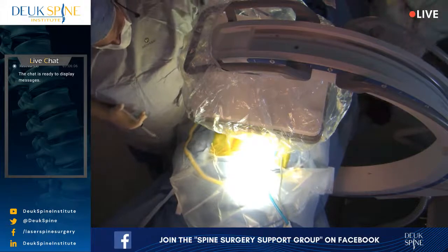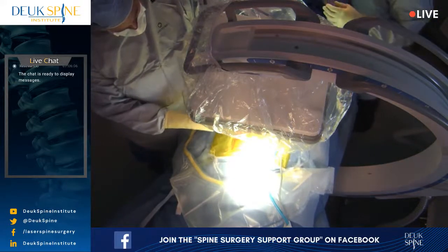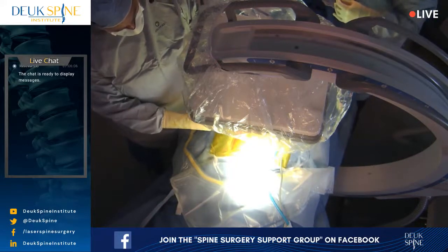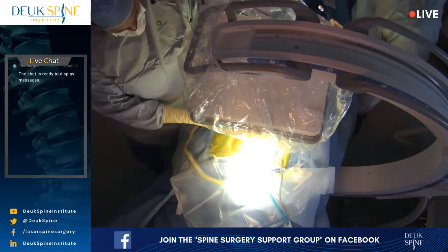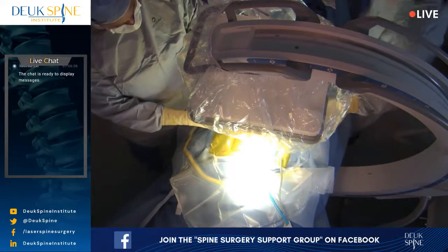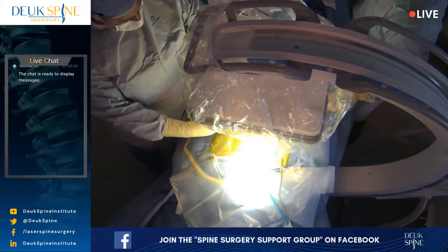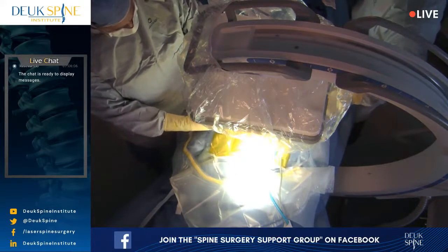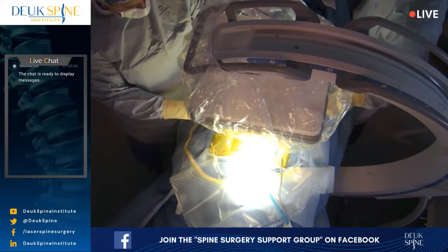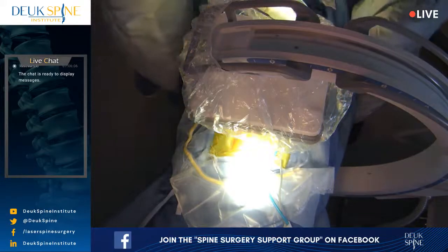Just lay still, okay? First thing we're gonna do is a little injection of some local, and that's to numb the skin up. That will help her with some of the discomfort of making the small incision, albeit it's only 7 millimeters or 1/4 inch incision in the skin. We should be able to fix both discs with that one incision. So I'm giving her a nice wide field of numbing. And once again, we're fixing L4-5 and L5-S1 disc. We've injected 6 cc's of local.